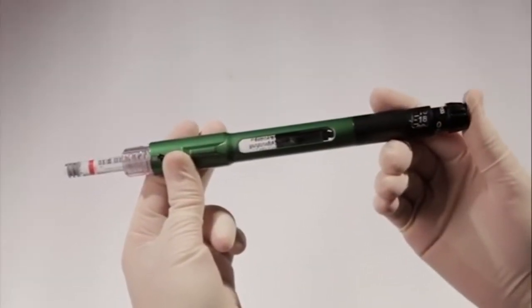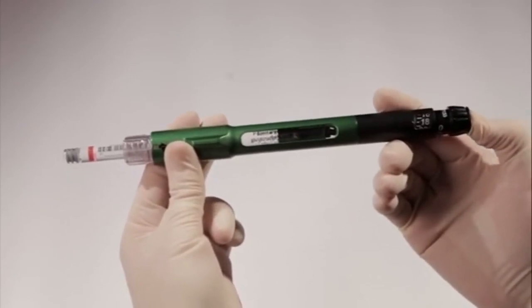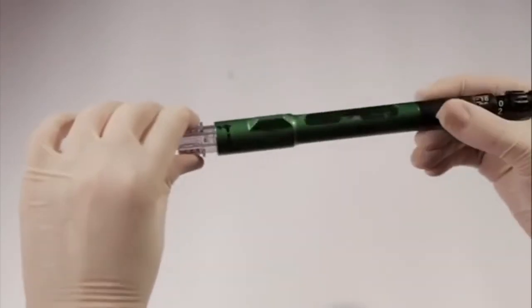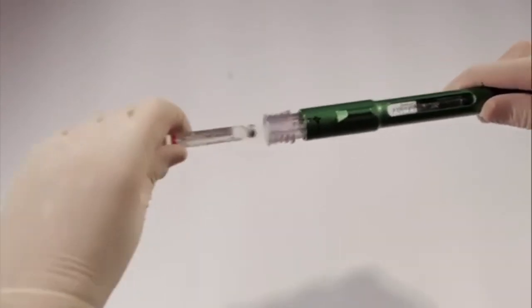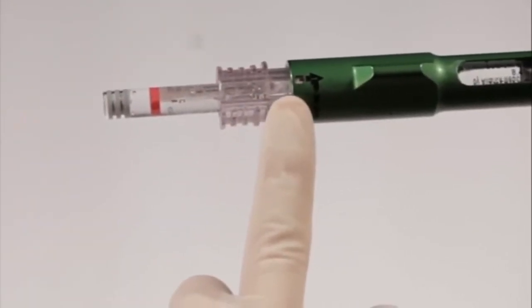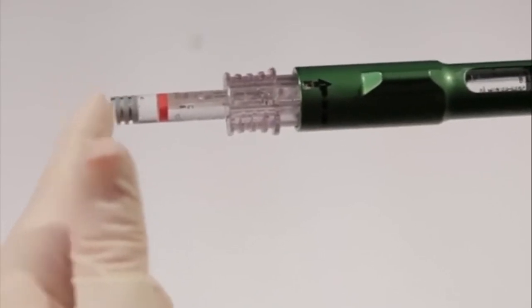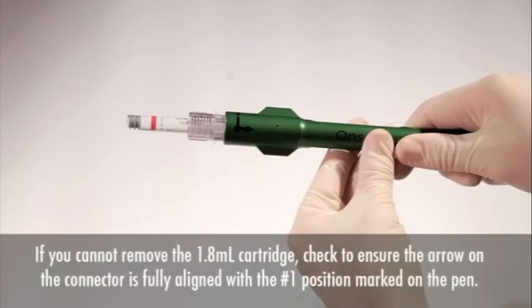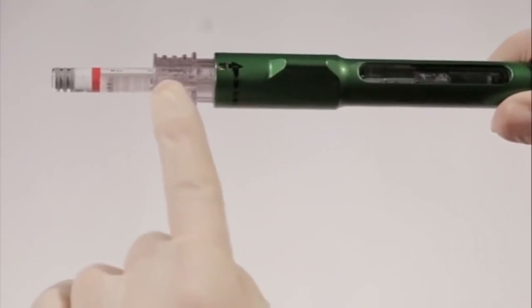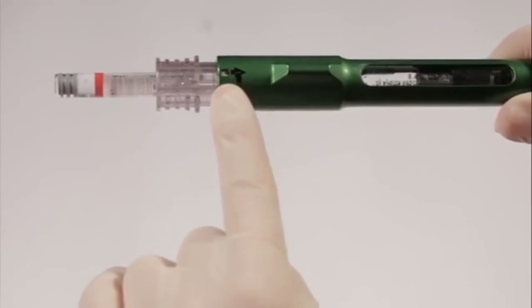If you cannot depress the dispensing button, it's another indication that the 1.8-milliliter cartridge may not be seated correctly in the cartridge connector. Do not force the button if you are feeling resistance, as this may damage the pen. Turn the connector to the number 1 position and remove the 1.8-milliliter cartridge by pulling straight out. Then reload the cartridge, making sure the connector is aligned with the pen in the number 1 position and that the metal cap of the cartridge is hidden from view in the connector, indicating the cartridge is fully seated. If you cannot remove the 1.8-milliliter cartridge from the connector, you may still be in the number 2 position, or may not have rotated the connector fully to the number 1 position. At any point other than all the way in the number 1 position, the cartridge is locked and can't be removed.